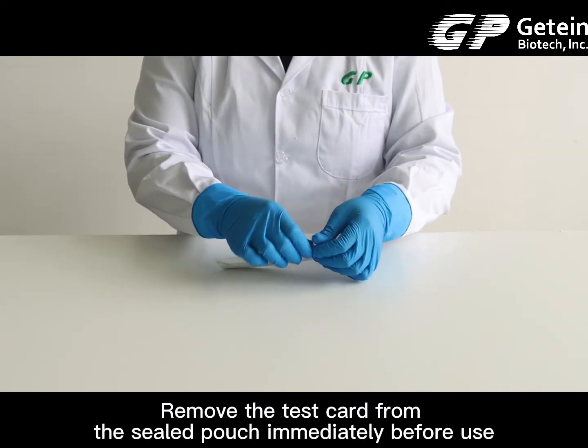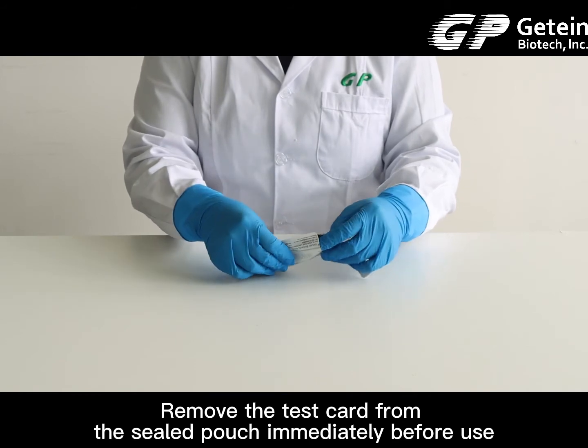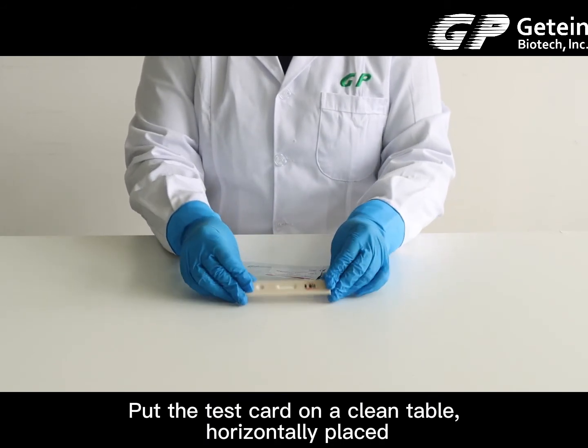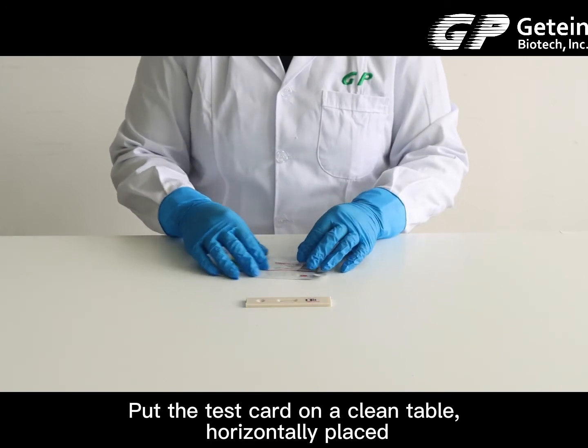Remove the test card from the sealed pouch immediately before use. Put the test card on a clean table, horizontally placed.